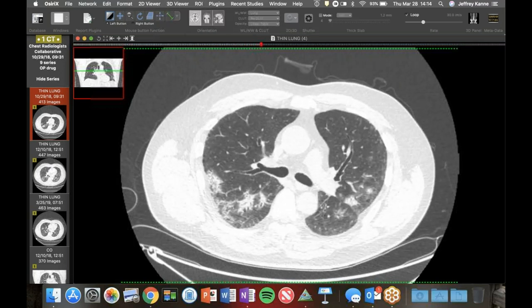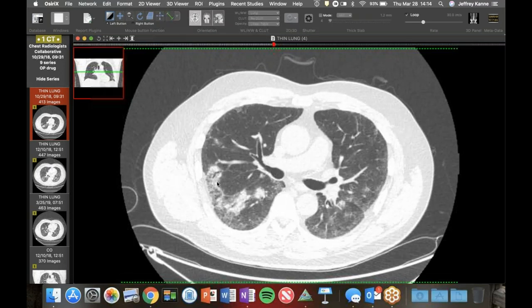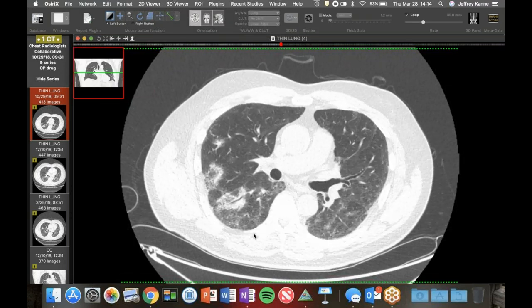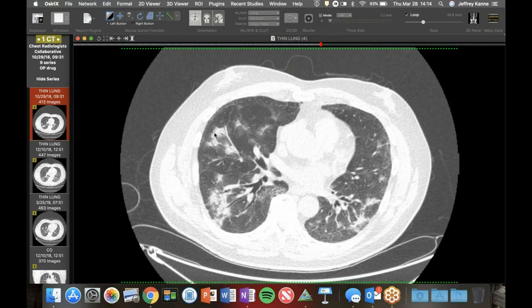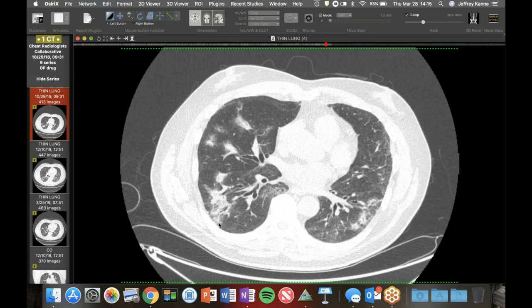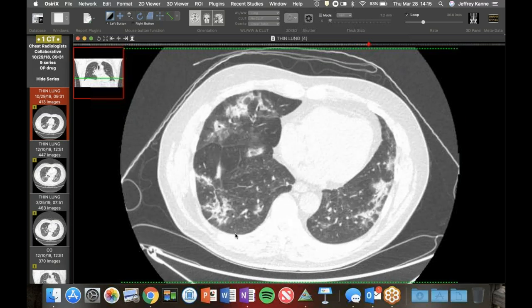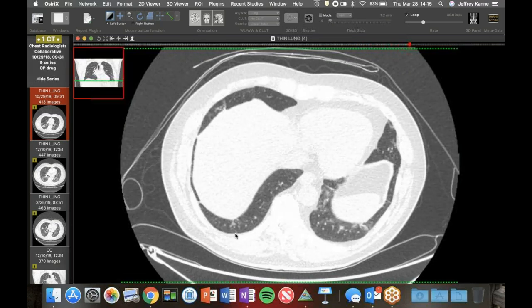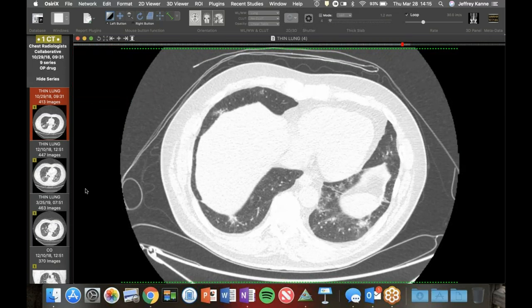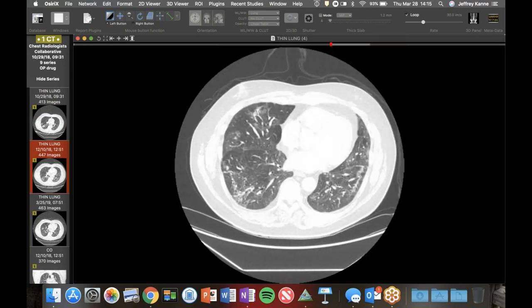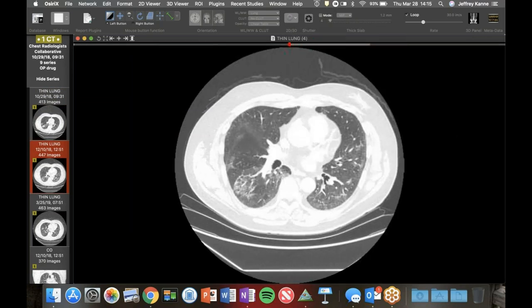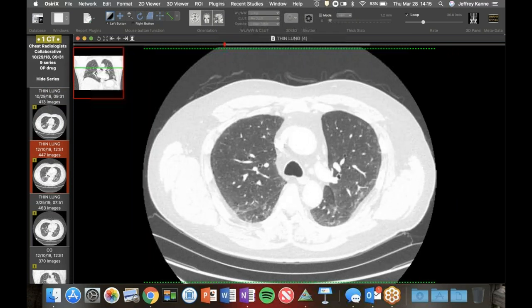Air bronchograms are preserved. Very discrete margination with the lobules - you see a lobule right there, and it just abuts the septum and the vein. Crosses several bronchopulmonary segments. Another good look for organizing pneumonia. The drug was stopped, patient was given steroids, and you can see it gets a lot better. It starts melting away - that's what we typically see. This was about six weeks later but definitely getting better.